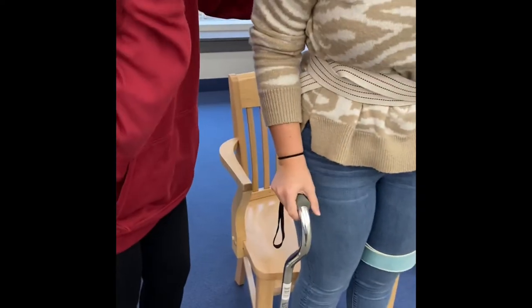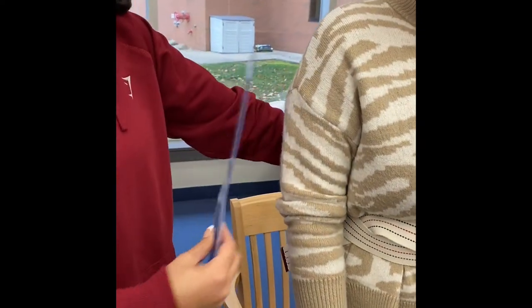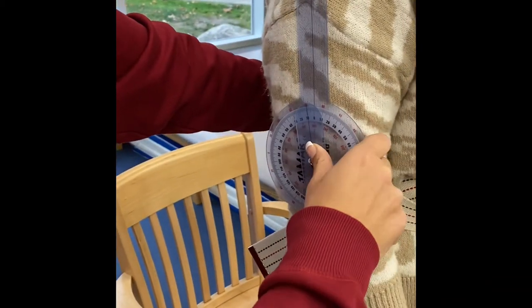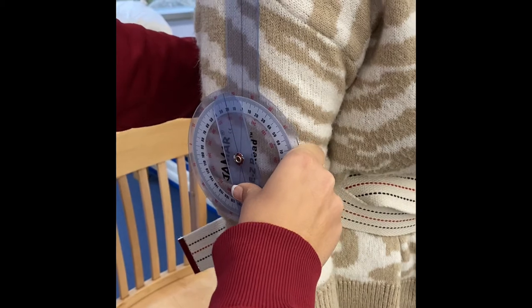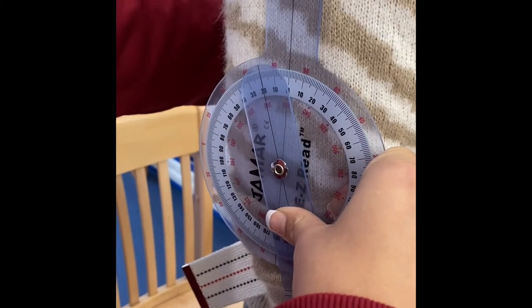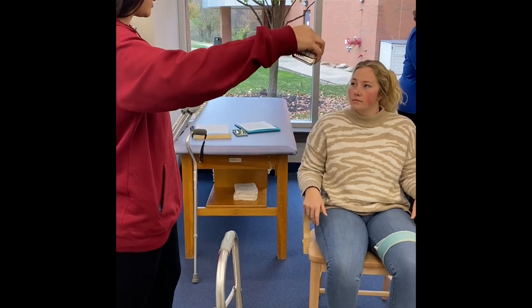I'm going to have you put it in tripod stance, which is two inches lateral and then four to six inches forward. I'm going to measure with the goniometer to make sure that the angle is correct. It should be 20 to 25 degrees, which is right at 20, so that is what we want. All right, so I'm going to get you fitted for a walker. I'm going to have to wrap this around you, like a big hug.